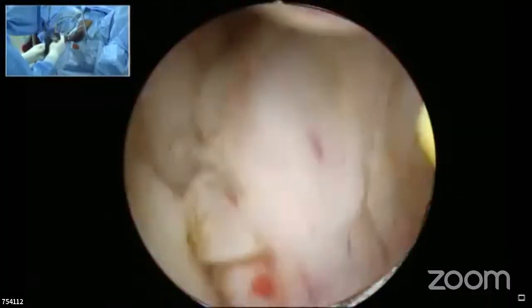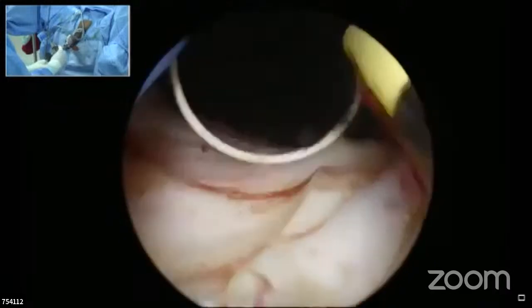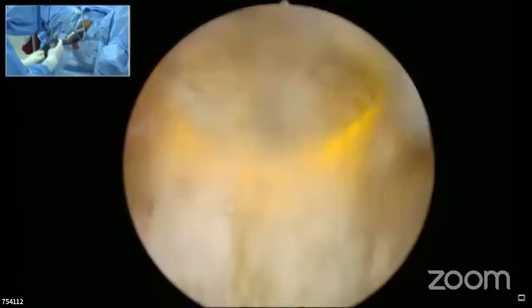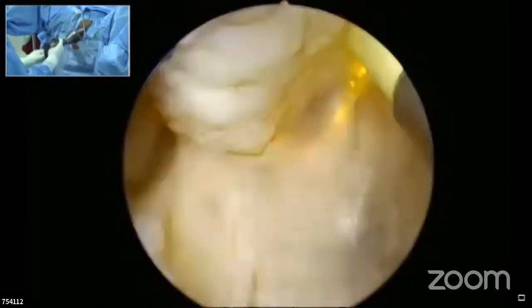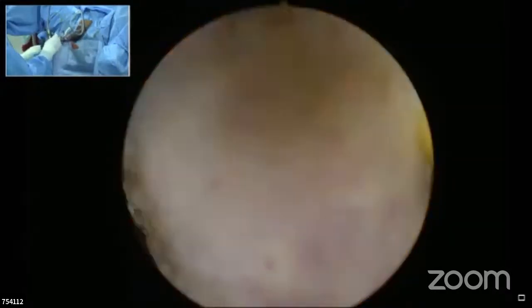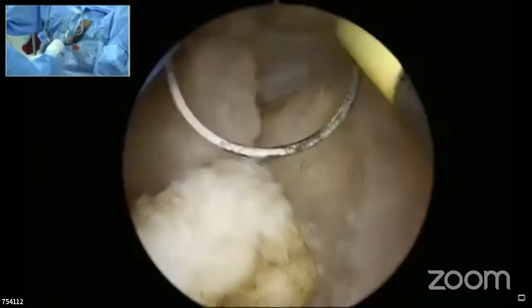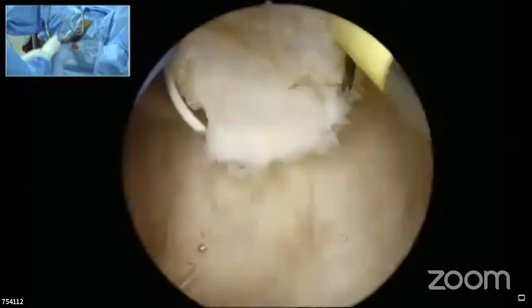Absolutely correct. Every time you come out of the prostatic fossa to reorient, you're going to have a grating effect at the sphincter level. Yes. Especially in a continuous sheath where there are holes inside, which will cause that sort of a crater effect.